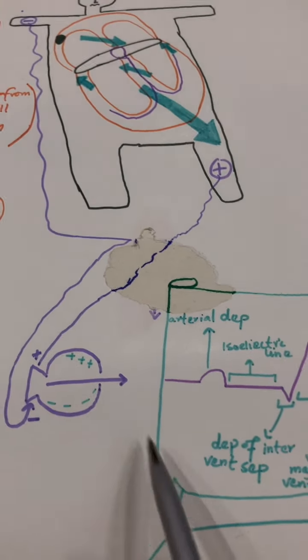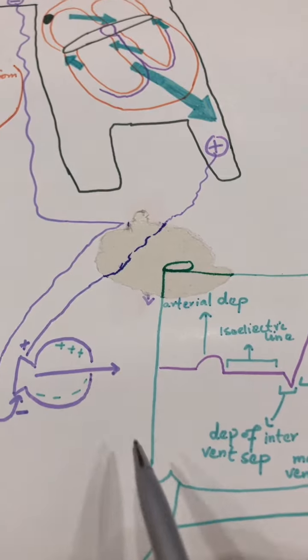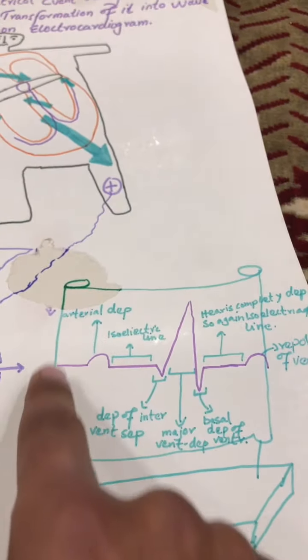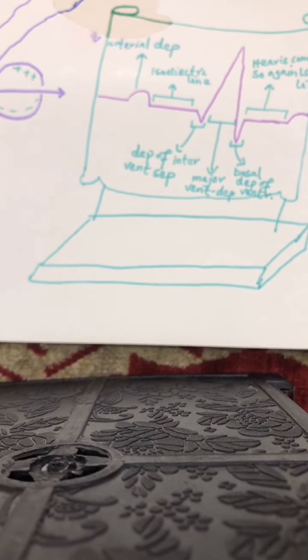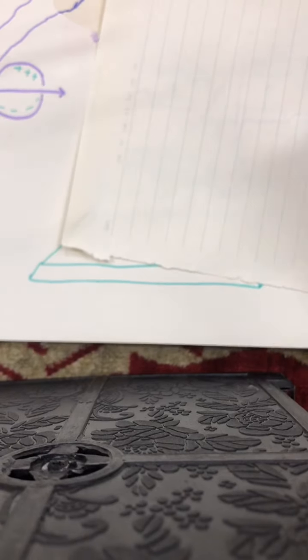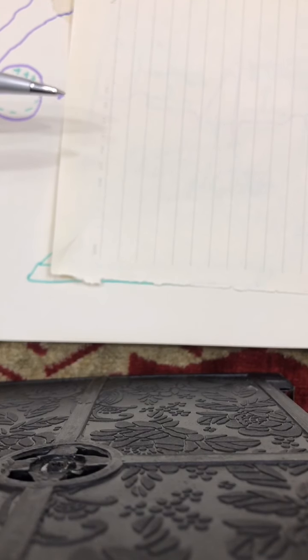Now what we do is put ink or color on this head. Okay, we take a paper. See, this is the paper. Okay, now let's assume there is nothing on this paper. See, let's consider this paper is blank. I will get a blank paper. Okay, and instead of this needle I will put my ballpoint over here. Okay, and we know that on the tip of this there is ink.